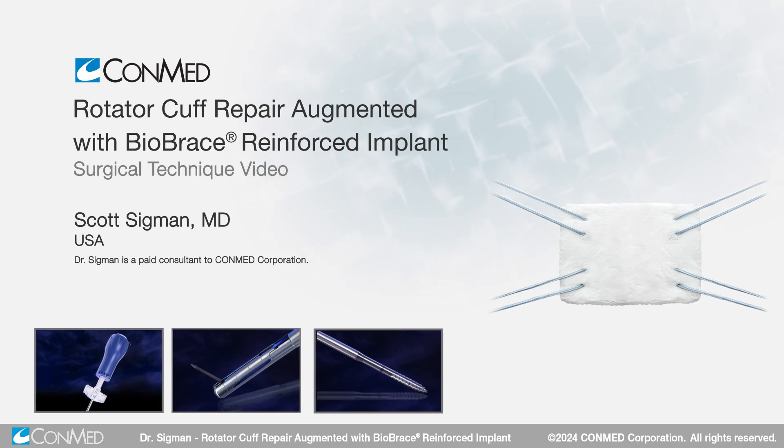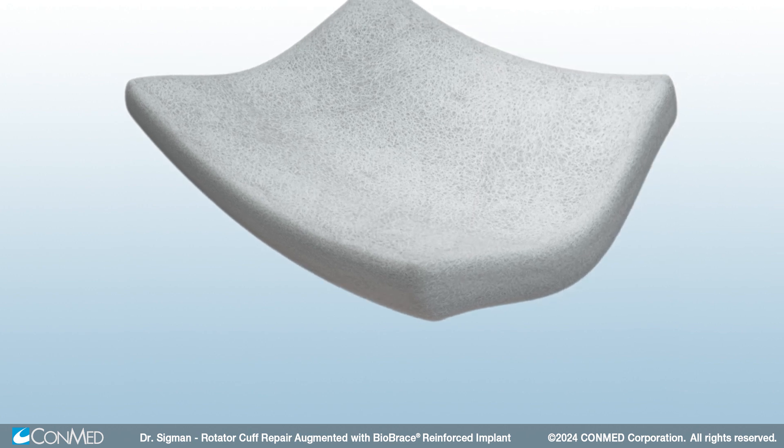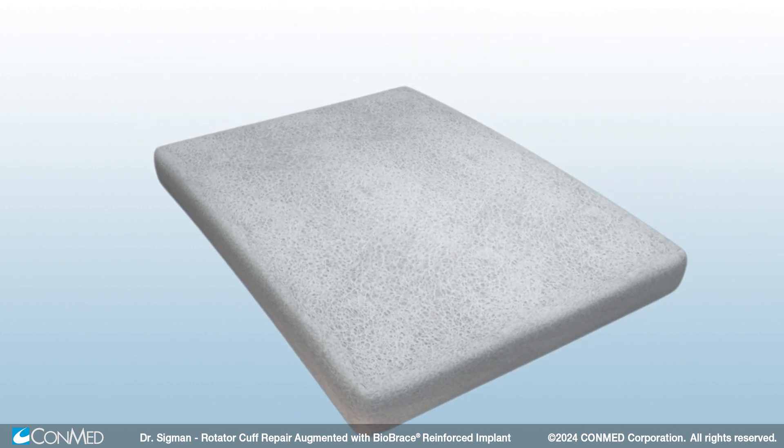Hello everyone, Dr. Scott Sigmund here to talk about a rotator cuff repair using a novel biologic implant. We're going to showcase the BioBrace implant, which has both biologic potential due to bovine collagen and structural support due to PLLA fibers.